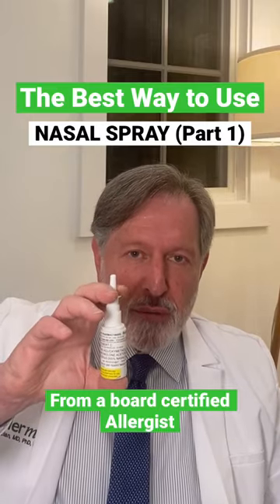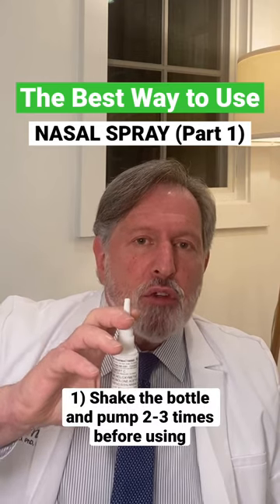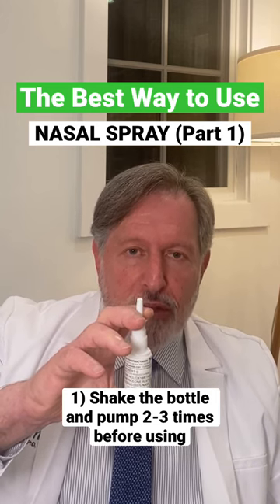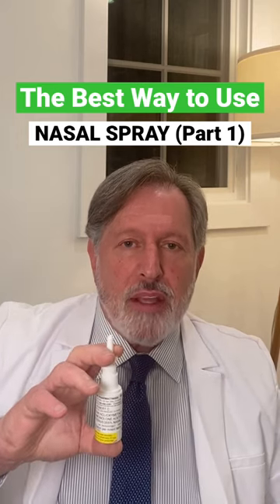If we're starting with a brand new bottle of Alleroo Super Spray, it's important to shake the bottle first, as we do before every spray, but also to pump prime the bottle two or three times until you see a nice full spray come forth from the nasal tip, such as this. And now the spray is ready.